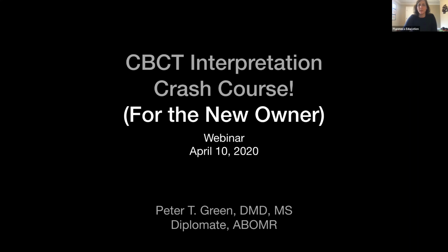Tonight we have with us Dr. Peter Green from North Carolina. And his topic today is CBCT Interpretation Crash Course for new owners and users.